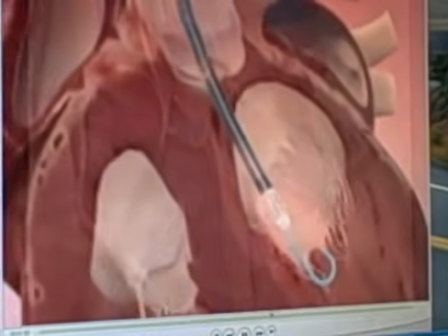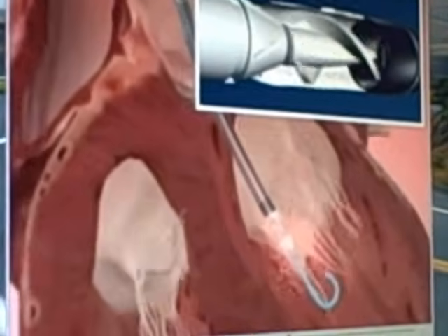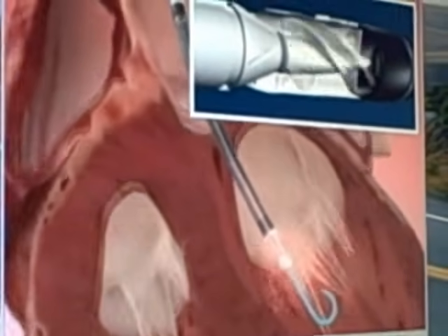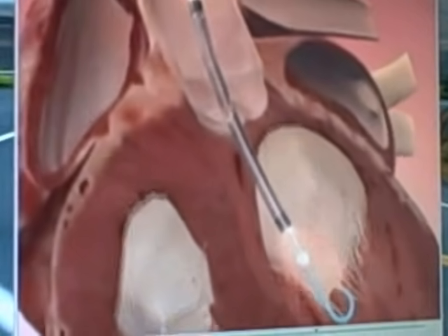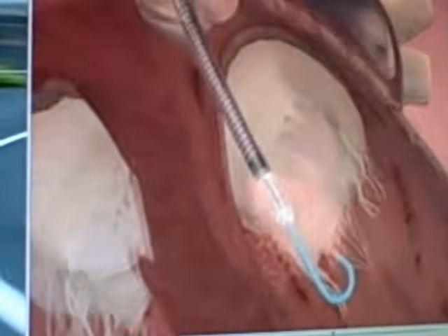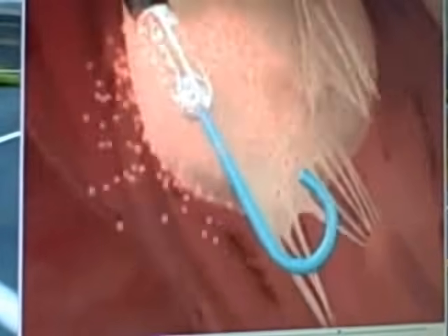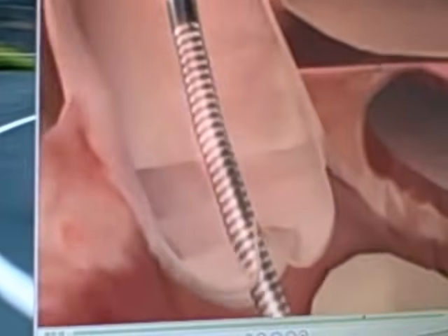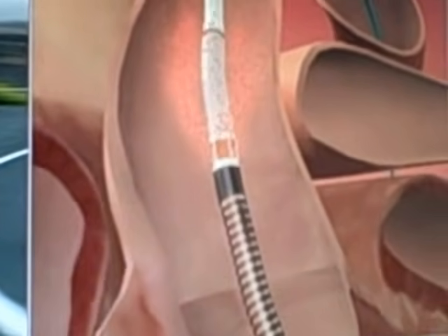At the tip of the device, blood is actively drawn in by what is called a microaxial pump. The blood is drawn from the left ventricle and pumped out, as shown here in a cartoon-like fashion. It is then pushed out above the aortic valve into the aorta and out into the rest of the body.